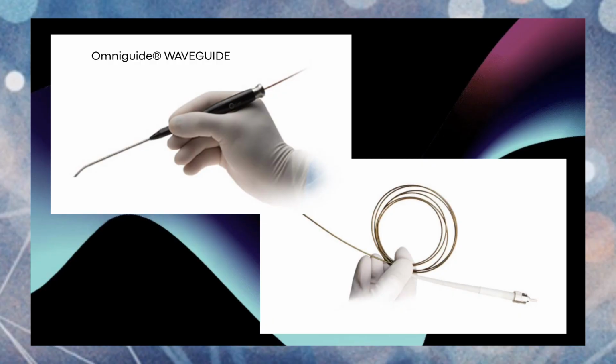So what they did is they graded them by the perfectness of their tube, and they have different ratings. You have an S fiber for stapes. It's actually a lower grade fiber, because they don't need it to work so long. Your neuro fiber or your other general ENT fibers are actually better grade in the machining. So this is what's going on with these fibers, and they do burn. When you're using them, all of a sudden you tend to smell something, which is a burning of the internal coating, and it just stops working. And if you clog the very tip of it, it will also stop working.